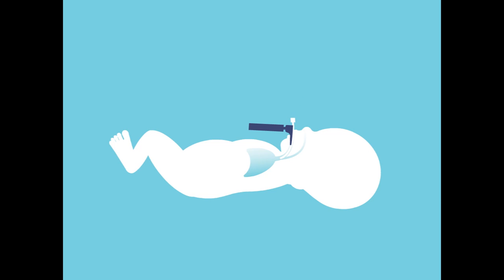The ET tube does not need to go far below the vocal cords. Once the ET tube passes through the vocal cords, the person performing the intubation will remove the metal laryngoscope carefully, leaving the soft, plastic ET tube in place.